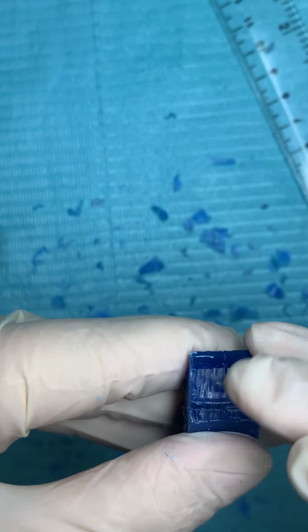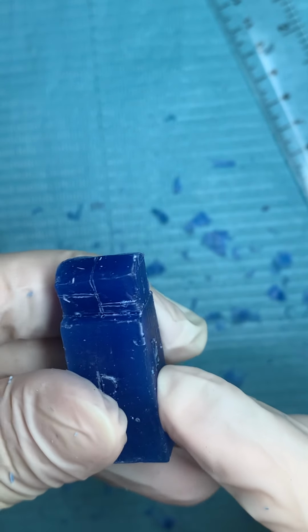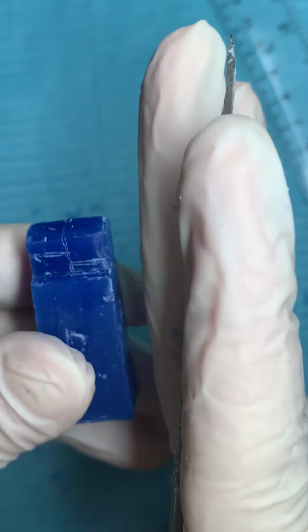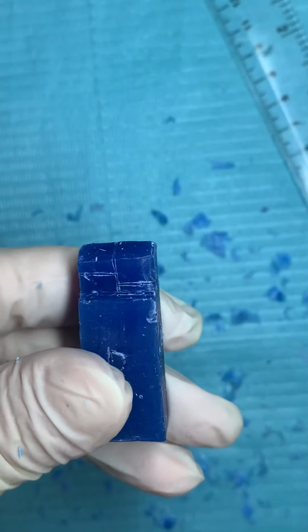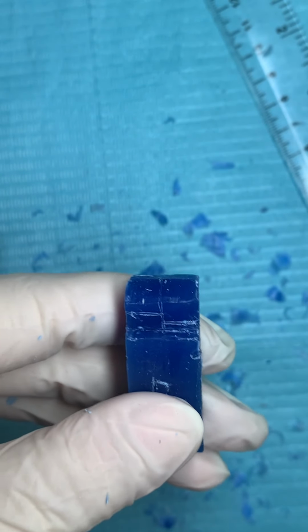I used to do what in the upper premolar? I used to make intercuspal distance, right? I measure here 3 millimeters buccally and 3 millimeters lingually. Now I have lingual inclination, so I need my buccal cusp to be not centralized, to be lingually inclined, and not normal inclination. No, it is severe inclination.